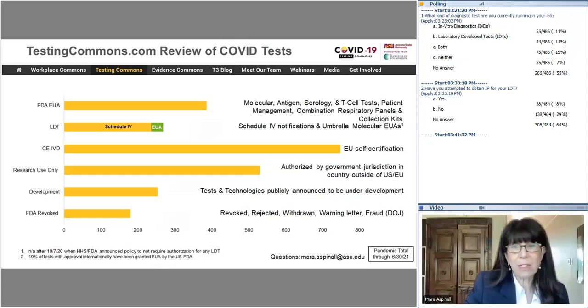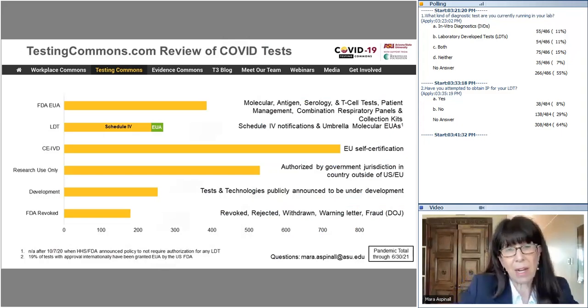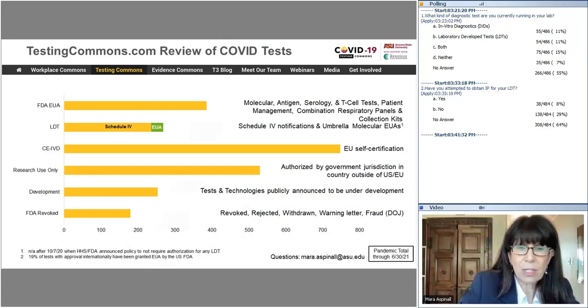So what are the tests out there? I'm going to continue and then I'll share the poll results in a few minutes. What are the tests that are out there? This gives you a sense. This is from 3 months ago, and in the next week there'll be an update here. But it just gives you a sense. The FDA has approved just over 400 tests. The IVDs in Europe, 750 tests. LDTs before that stopped for about 300, and then you could see development.